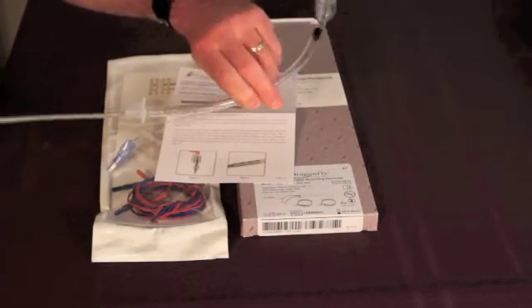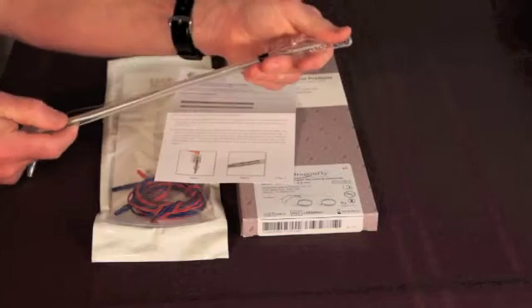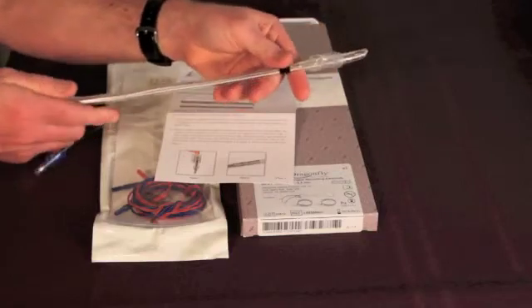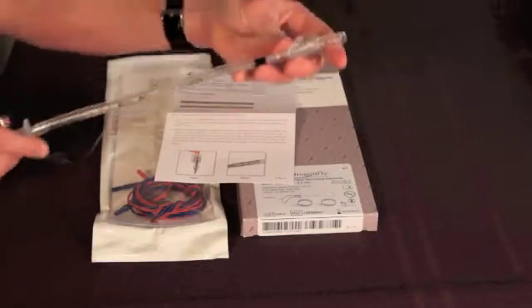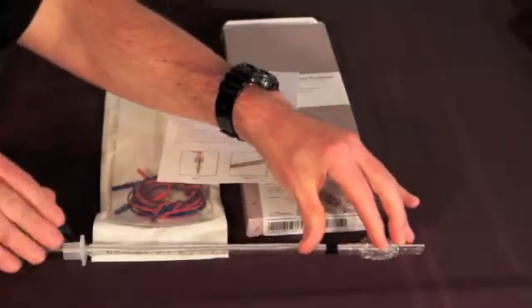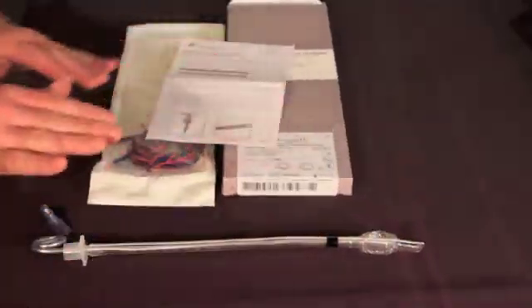We recommend the use of a stylet to straighten the endotracheal tube when applying the electrode, and I will turn it over now so that the bottom or posterior side of the tube is facing up.